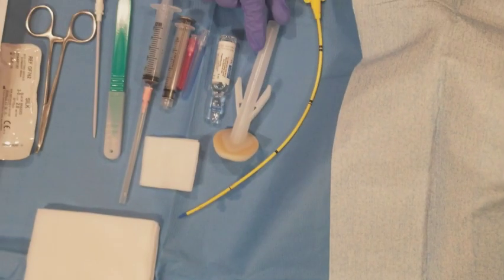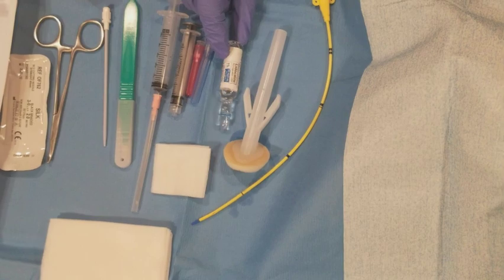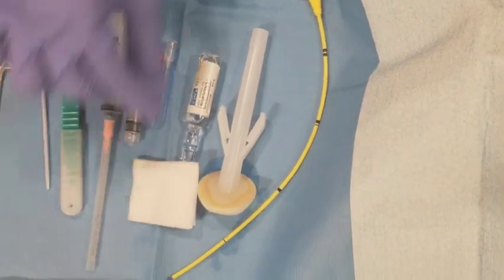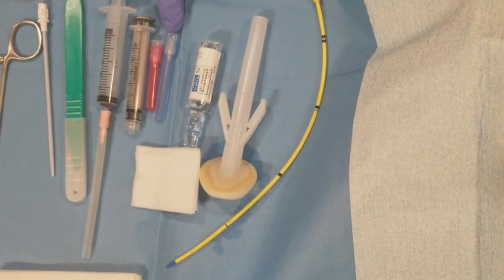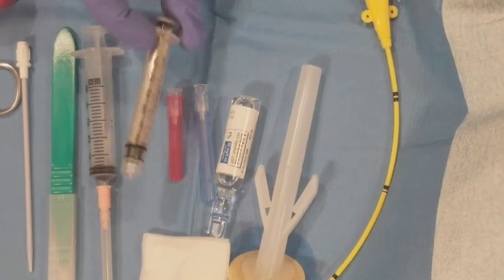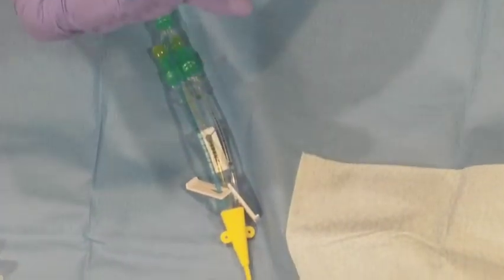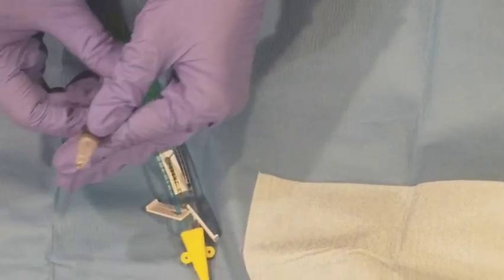After you're done cleaning the skin, you want to anesthetize the skin. Right here we have our 1% lidocaine, and we have our gauze here to break open the lidocaine. Okay, we have our drawing up needle, and we have our injecting needle. And this is our 3cc syringe for the lidocaine. So I'm just going to attach this drawing up needle.